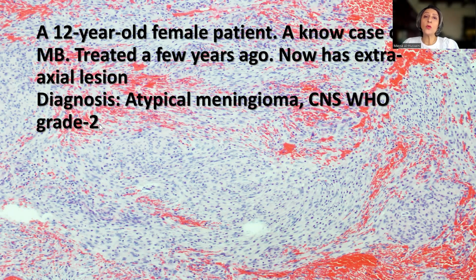So remember always to use Ki67 in your practice in meningiomas. Number one, try to estimate the Ki67 proliferative index, and number two, try to find your hotspots, and on those hotspots you can either count the mitosis directly on the Ki67 or mark the same area on the H&E, and start your mitotic count. And believe me, it works very well.